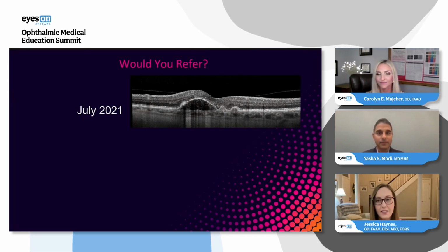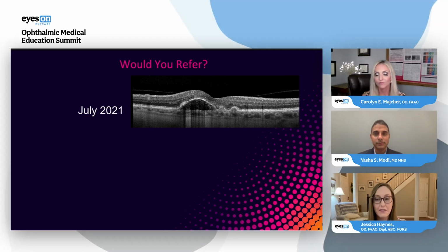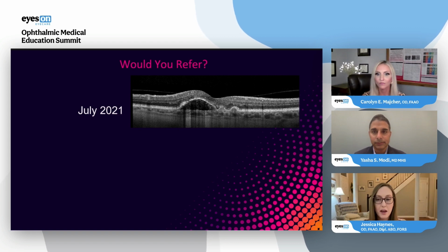That's a great question. The choroid is definitely an important aspect of managing and diagnosing patients with macular degeneration. Patients with macular degeneration on average do tend to have a thinner choroid than certain other conditions that can cause RPE defects, such as pachychoroidal syndromes. So it is nice to measure the choroid to get a sense, how thick is this? Is this more consistent with macular degeneration? Could this be more consistent with some other type of macular disease? And also, patients with thinner choroids may be more apt to develop geographic atrophy, and those with geographic atrophy may be more prone to progress.